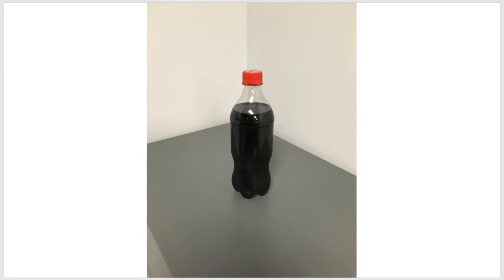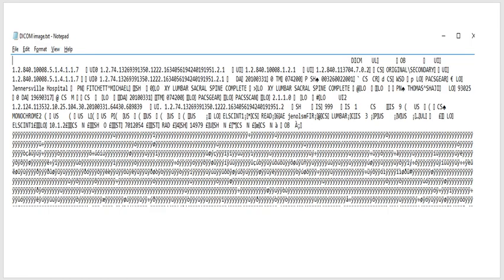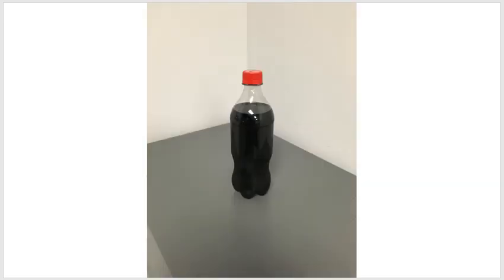To go back to this file: right here it says 'X-ray lumbar spine complete,' so I know that this image down here — all those characters I can't read — is a picture of a lumbar spine because the DICOM header tells me so. If you took the DICOM header off, you would just have a bunch of image pixel data without knowing what it is.